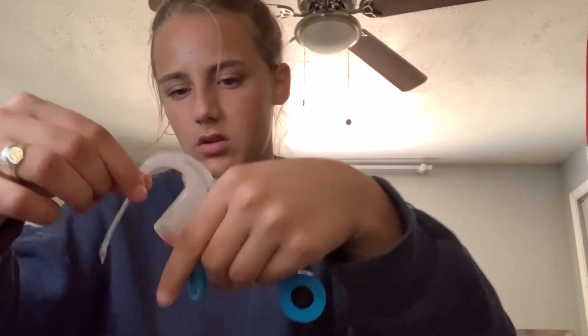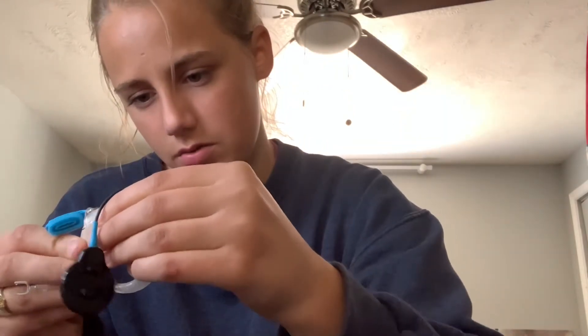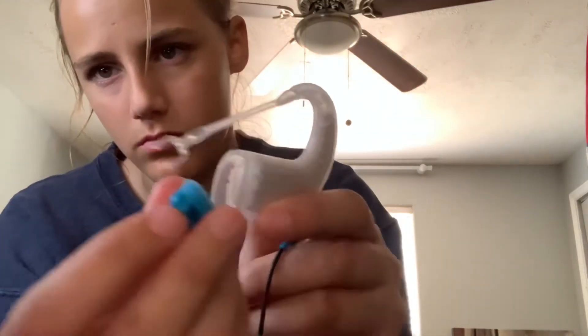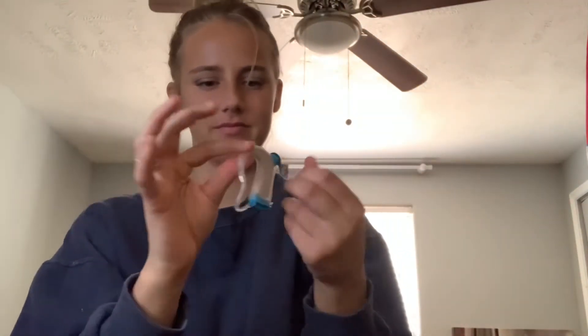I'm going to show you how to put my processor in here. I take this thing off, take my processor — so you just take that coil off because you already have the other coil in the Aqua Kit, then push it in because it's just really flexible plastic. Then you put that piece in and make sure it's secure. I actually didn't push it in well enough at first so I didn't hear anything, and I thought my processor was broken — but it's not!